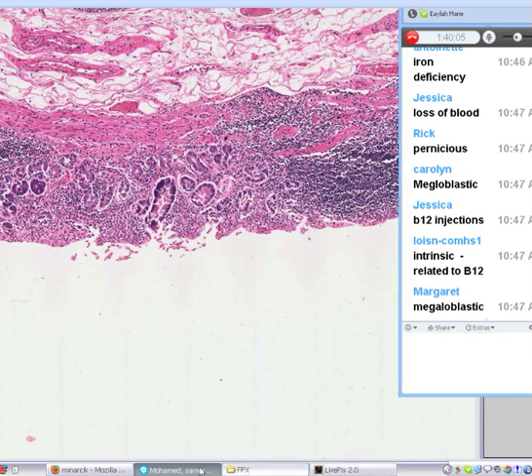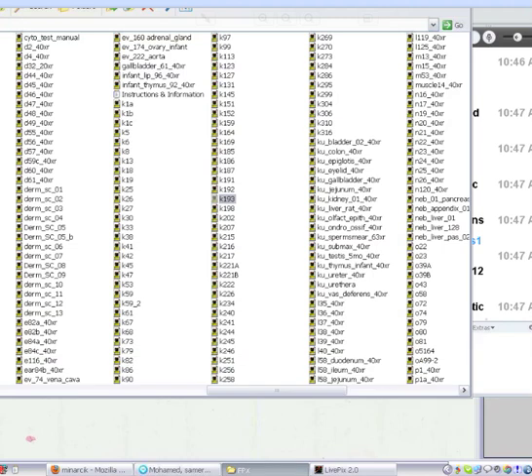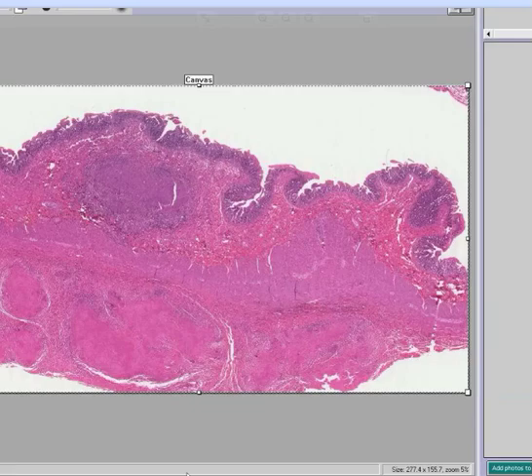last stomach case, and then we're going to go to liver. In fact, we may just do a couple of liver cases here. But I want to do one more stomach case that's going to be kind of interesting. It's called case 68. And here it is. And I should probably get rid of this old one here. And probably in about 8 seconds, everybody's going to see this slide.